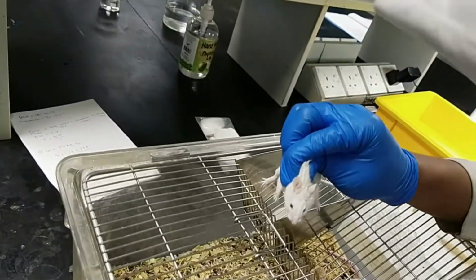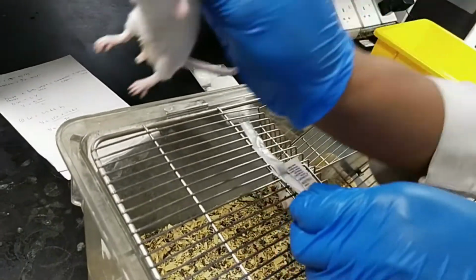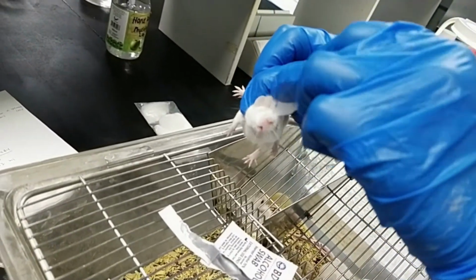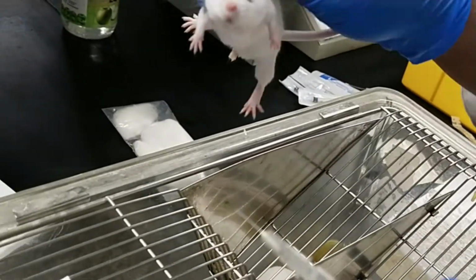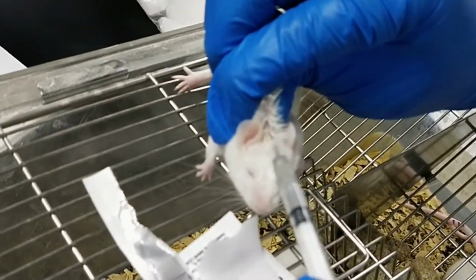Okay, and then we need to apply the alcohol swab at the injection area. And then we need to pierce through the needle at the injection area, which is around here.